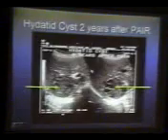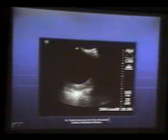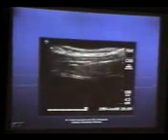This is a fairly recent patient that I got, and the patient is on albendazole. Before the albendazole, it was just a unilocular cyst like this. Note the date, 8 June. And now 7th July, the membrane has started collapsing. We'll do the PAIR procedure later on. Another patient, hydatid cyst, fairly frightening look. Can be confusing sometimes, but you have to look for the wall.